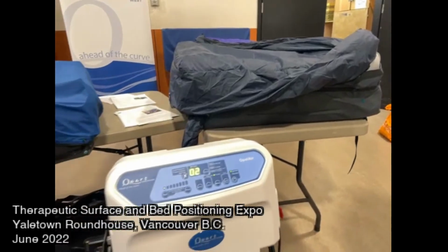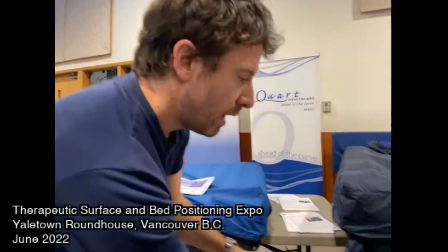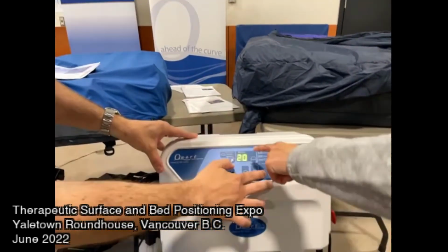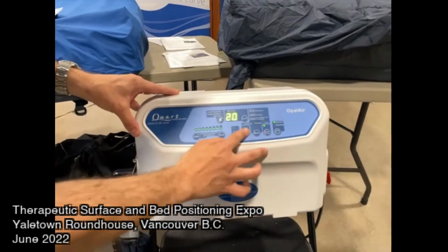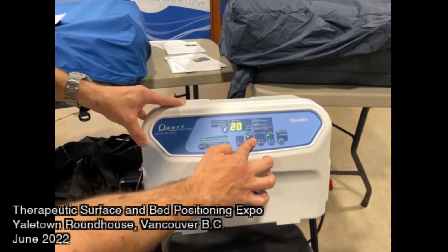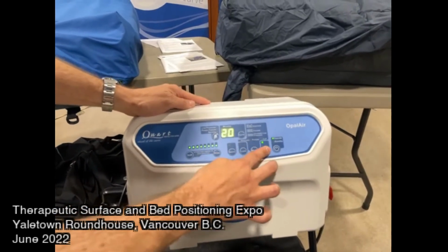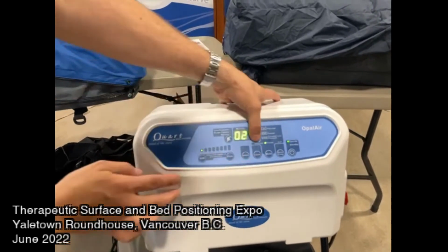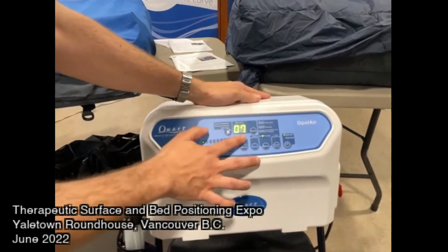Pulsate is when all the cells reduce pressure by 30% before coming back up. And then constant low pressure. Oh, sorry, that's gone to autoflow. So you can select your cycle time. If you're in Pulsate, for example, you can select your cycle time. For all the modes, you can select cycle time.